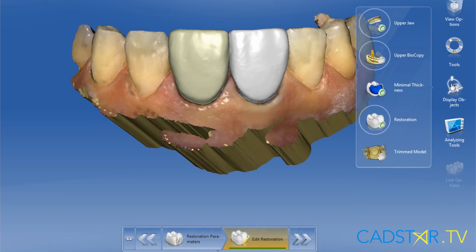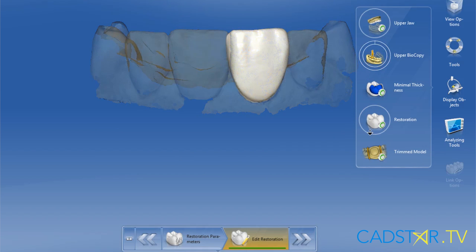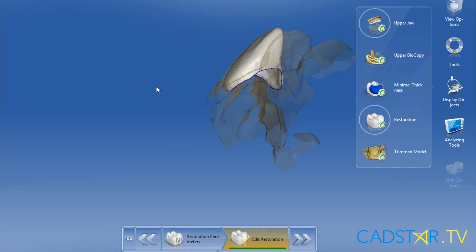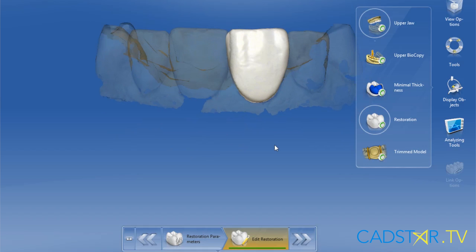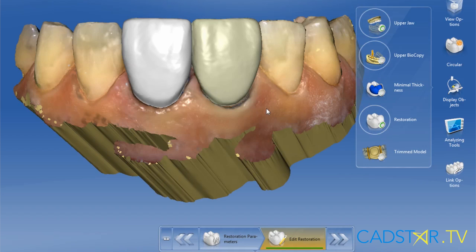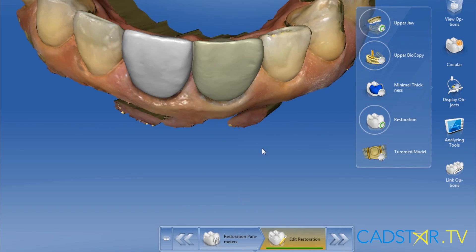I'm going to set the proximal contacts and make sure the margins are filled out for milling. Using the biocopy display transparently, I can trim the model where I just see the tooth embedded into the biocopy display. The biocopy display will act as a matrix to allow you to define your proximal contacts, assuring that your midline and F-points stay right where you want them. Anterior teeth with biocopy are a slam dunk to reproduce your wax-up or your mock-up in the mouth.